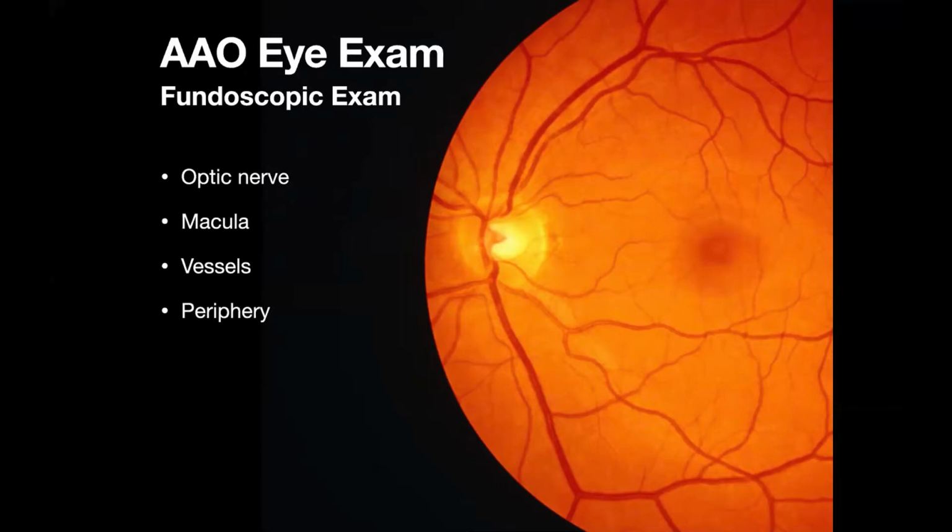like that retinal area. And the hard part is this is really hard to accomplish without good equipment, without dilating the eye, and frankly, without lots of practice. If you talk to an ophthalmologist, they'll say, oh yeah, using the ophthalmoscope, it's like shooting fish in a barrel. Well, I don't know, but I have a BB gun trying to shoot minnows in a very, very small barrel through a very, very small hole. And so it can be challenging in the ED context.